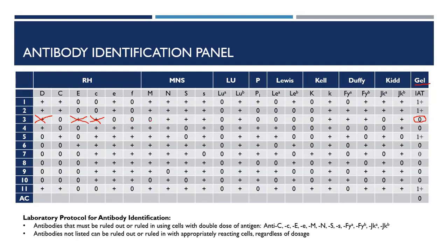F is not present in this case. We have a homozygous expression of N here. I cannot rule out either anti-big S or anti-little s because of the heterozygous expression of both antigens. Lutheran B I can rule out. Little k. Can't rule out either Duffy, heterozygous here, and JKB.